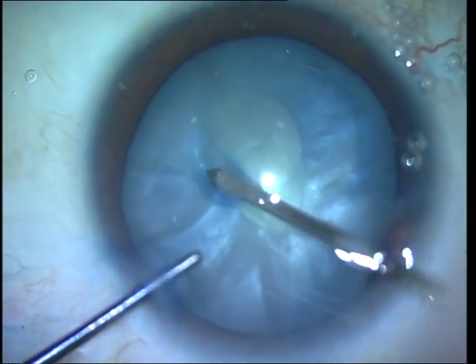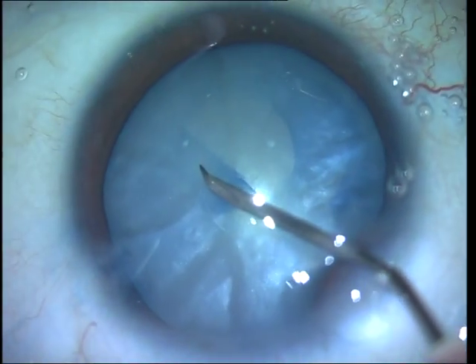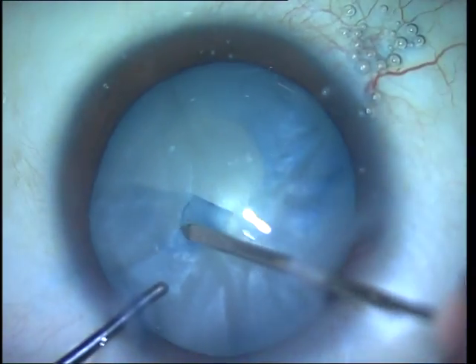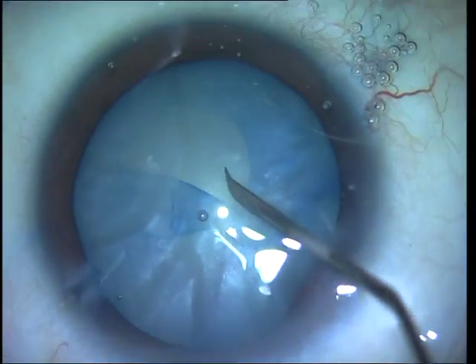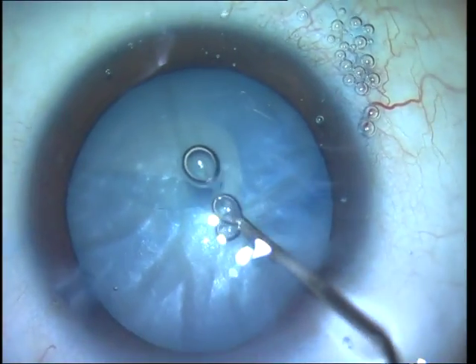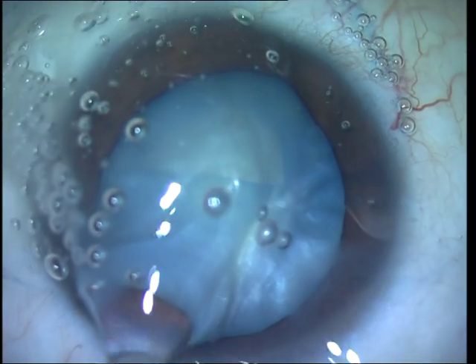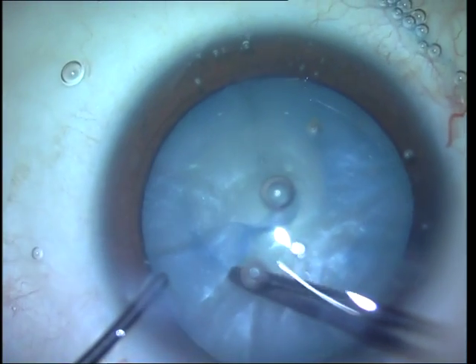This is a young patient who suffered trauma, and therefore I have problems with my rhexis trying to run out, partly because of the elastic nature of the anterior capsule and also partly because of the flocculant lens material increasing the intralenticular pressure. As I continue trying to do this with a 26-gauge needle the rhexis is starting to go outwards. I try and aspirate that flocculant lens material as in the previous case, but there is not much milky fluid that comes out, so that does not help in decompressing the intralenticular pressure.